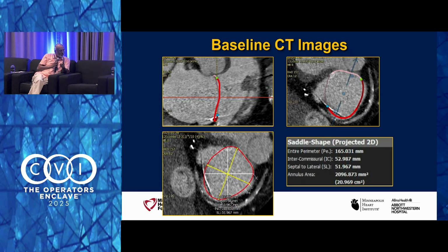Diastolic and systolic flattening together is also bad, whereas pure diastolic flattening is very hard to see, because we treat TR so late that almost invariably 80% of them have systolic and diastolic flattening, which is a reflection of pulmonary hypertension. And that's the problem. What we have found is it's a good way of anticipating problems in this RV if there is septal flattening in systole. It's not that we don't treat them.